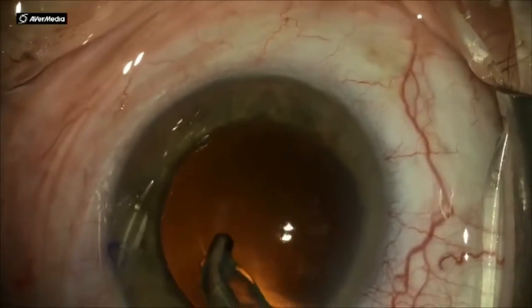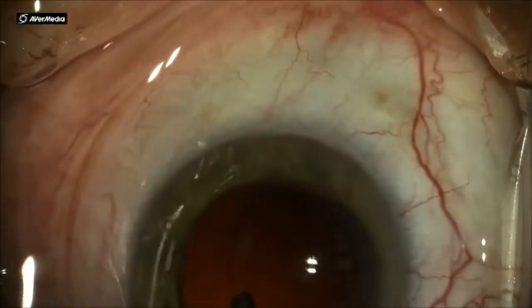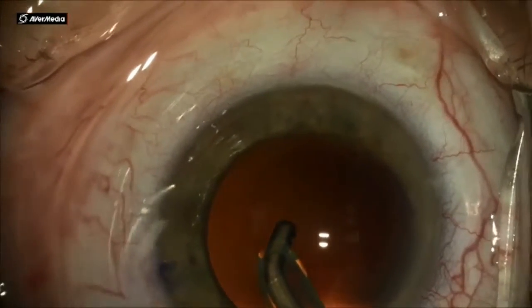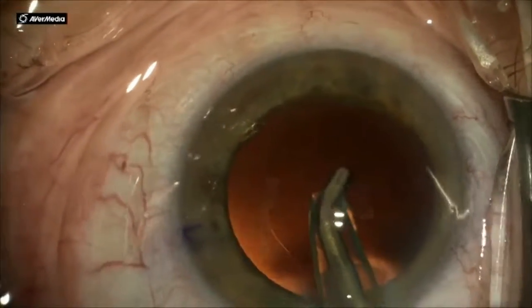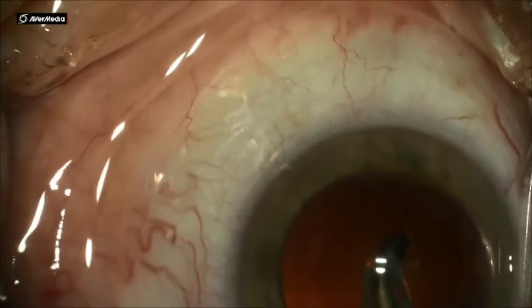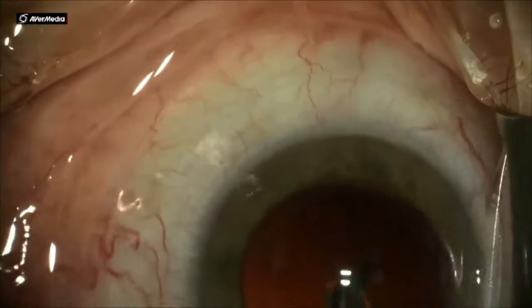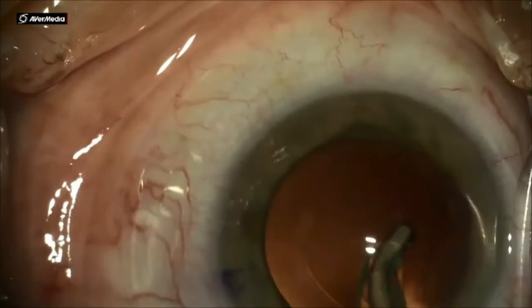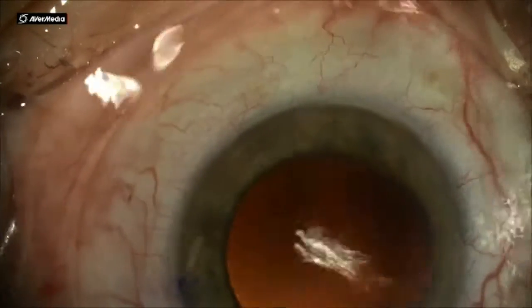And these are the tendrils — they look like seaweed or kelp underwater. They're attached to the posterior capsule but float about, and I very gently remove as much of those adherent fibrils of cortex as possible before the next step, which is implant insertion.